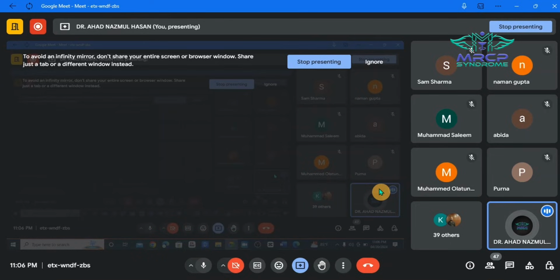So it should be at least 36 hours in case of ischemic stroke to have evidence in the CT scan. So acute ischemic stroke less than 2 days, go for the MRI. But when the duration is greater than 2 days, you can also go for the CT scan.